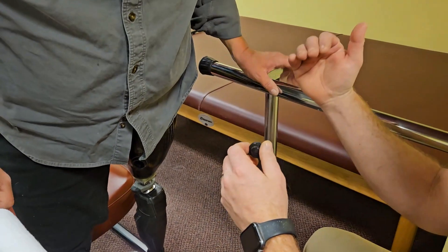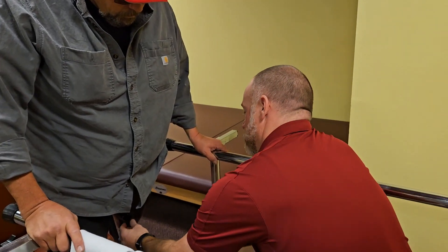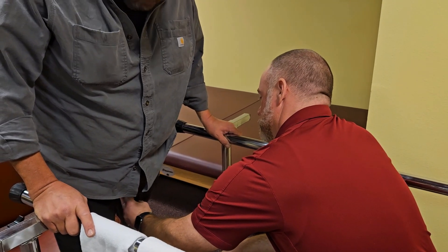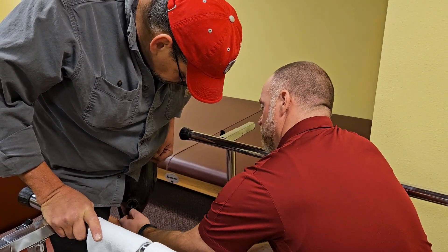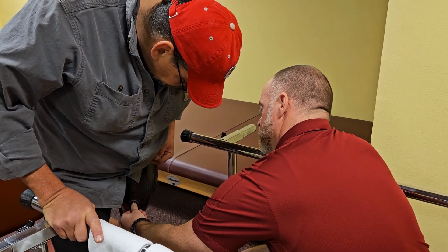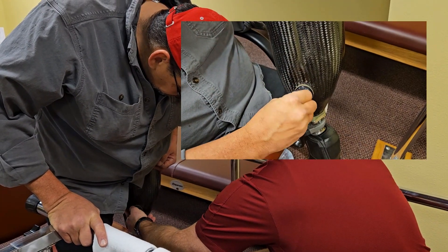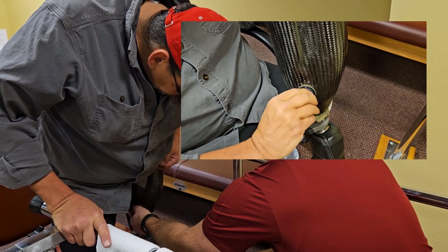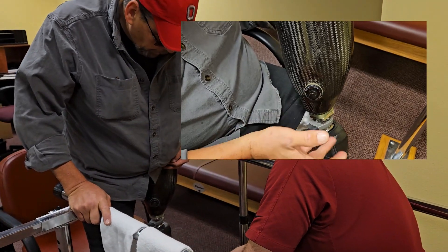Without the valve, the limb is going to continue to slide in and out. When you put the valve in, one tip: it's just double-threaded plastic, so if you cross-thread it, it will ruin it and cause a malfunction. Always go back a little first — lefty loosey — and then tighten to the right. You only want to finger-tighten this. If you use a tool, you'll never get it loose.